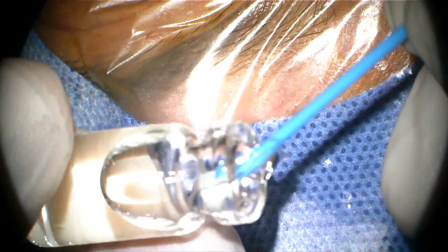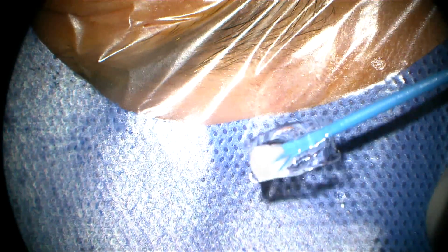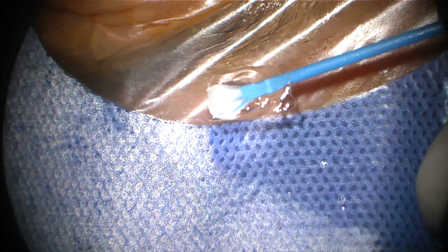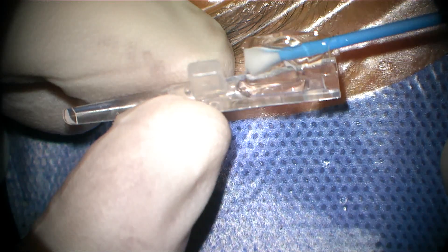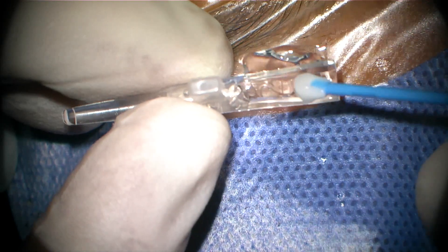We are going to implant the posterior chamber IOL, typically known as the implantable collamer lens — the ICL. We are going to get this lens out of the container and load it into the cartridge. The cartridge dedicated for the lens has been filled with BSS and methylcellulose.